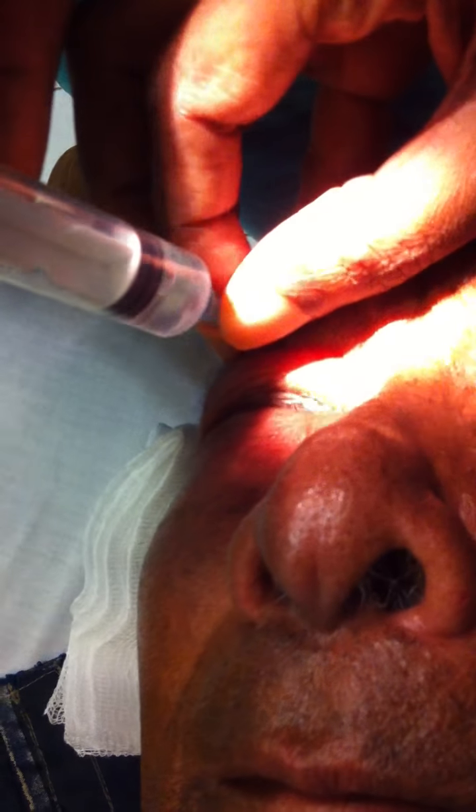You should not touch the bone either. When you're in doubt, this is in the specimen. It should go easily.